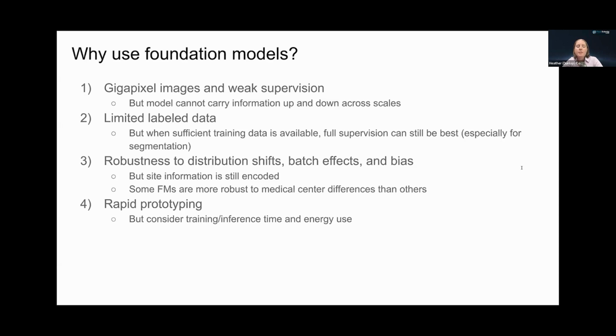So these are all great reasons for using foundation models, and I'm not at all trying to discourage you from using them. They bring a lot of benefits. I just want you to be aware that they are not a panacea, and to think carefully about your use case. My main focus today has been on tile-based foundation models, and that's very much where we started in the pathology domain. But before wrapping up, I want to give you a brief hint at some other cases for foundation models that go beyond tiles.